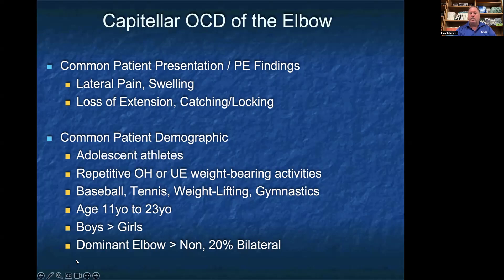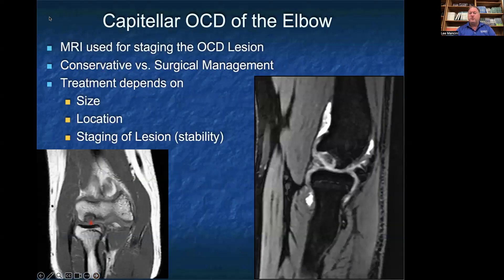As with the other two common OCDs, MRI is used for staging of a capitellar OCD as well. This guides our management, whether it's conservative or surgical. Treatment depends on size, location, staging of the lesion, and how stable the lesion is. On the bottom left MRI, where that red arrow is, you can see a capitellar OCD on a coronal slice. On the right, a sagittal slice shows the OCD lesion on the distal humerus just above the radial head, with fluid behind the image and the small piece of the capitellar OCD visible.